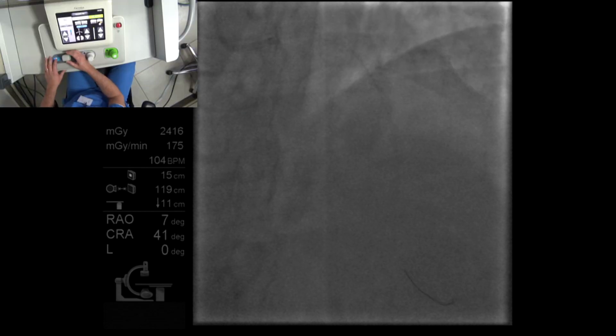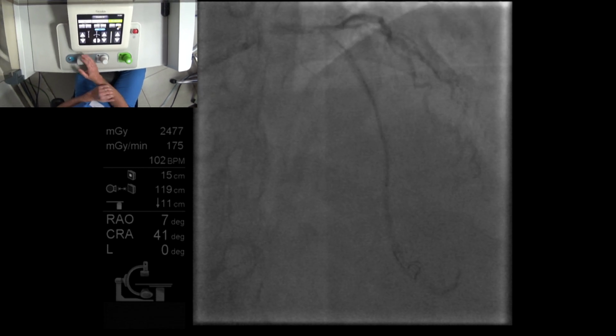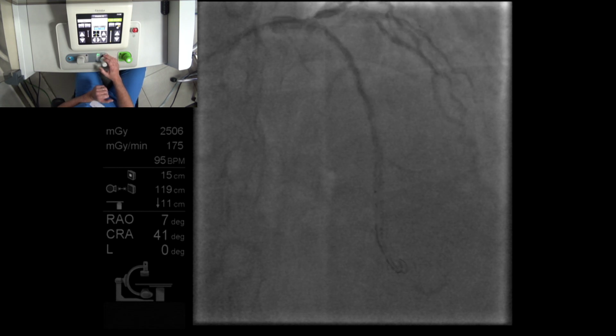Show me the distal wire. I'm going to reposition the distal wire, please. Oh, you guys did reposition it. Thank you. So coming in, I'm going to go ahead and advance my guide a little bit for some support. Yes, it has gone. Lovely. Let's have a test here, please. Wire. Yep, I'll fix that. Oh boy, it loves that branch.